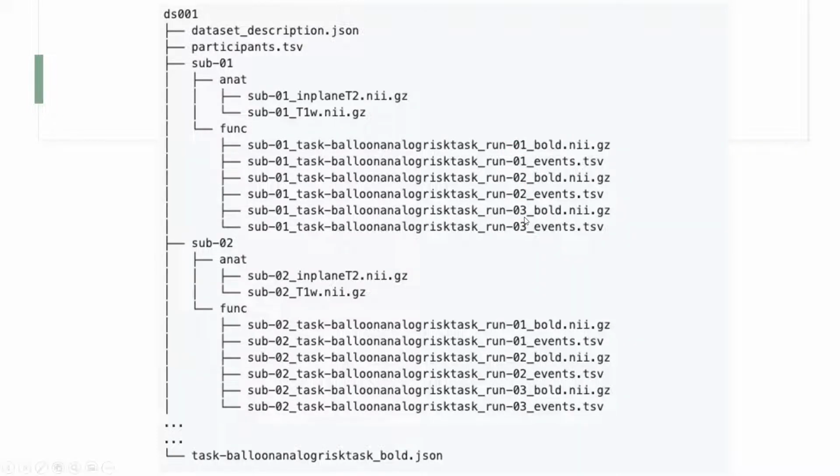One thing that is specific about the BIDS dataset is that you get JSON files like this that contain meta information from the DICOMs that is not really stored in the NIfTI. That would be the recording parameters, the sequence parameters, effectively.